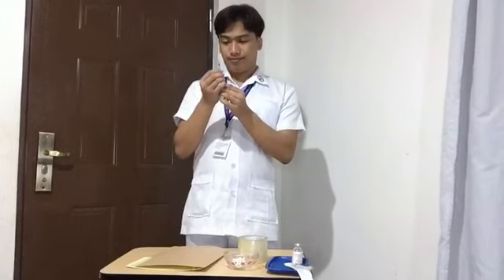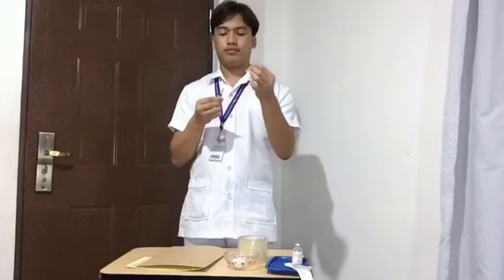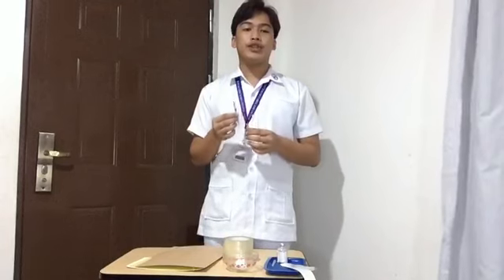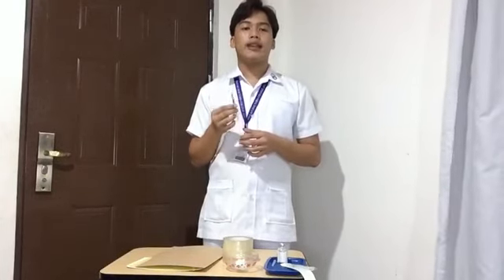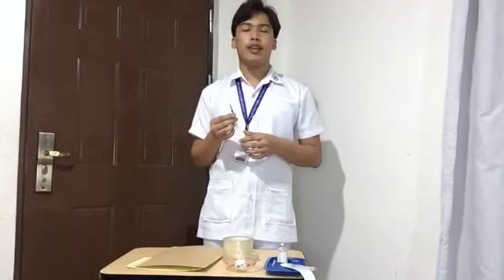Next is remove the cap of the needle, then draw up into the syringe an amount of air equal to the volume of the medication to be drawn. So next is carefully insert the needle into the upright vial through the center of the rubber cap, maintaining the sterility of the needle. Next is inject the air into the vial, keeping the bevel of the needle above the surface of the medication.